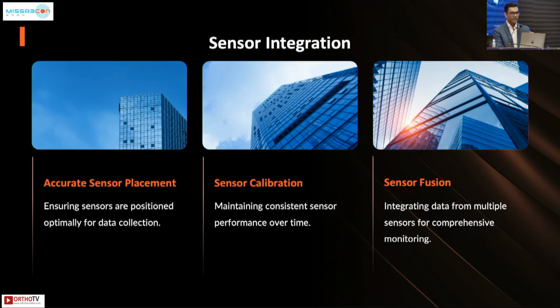Accurate sensor placement. So the sensor placement is what decides how the mobility happens, how the muscle contractures, and then you have to train those muscle groups. So we have to choose the muscles that are active and the muscles that are paralyzed. And then based on this technology, we have to make the active muscles work with the sensors, and then you have to make sure that the passive muscles are used by the exoskeletal. So sensor calibration, identifying the sensors, doing multiple EMGs is a key, and so there's a lot of work that happens before you even design it for a specific patient.